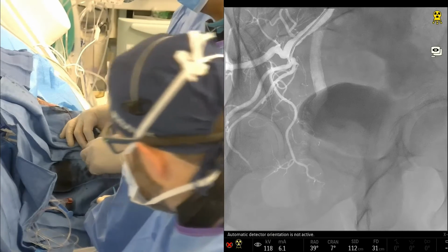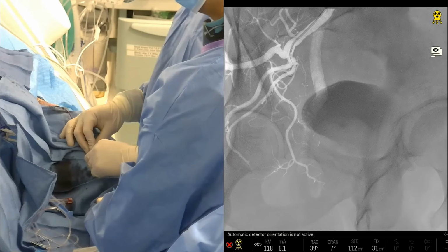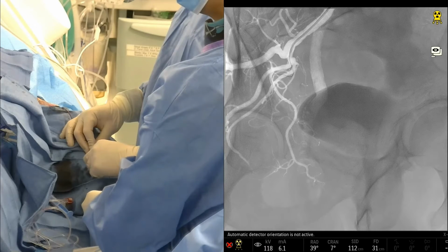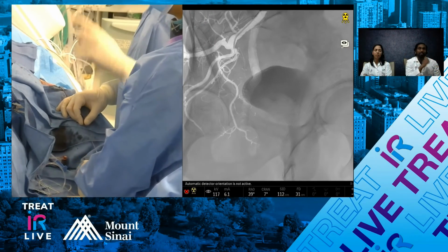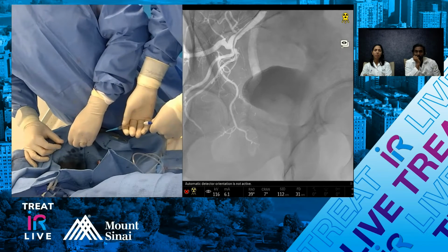Sorry, I missed that. So we switched. That might be it. Keep going. I thought it was a more lateral one. Maybe not. That's the rectal. More posterior. Do you want to shoot it? We can shoot it, but that's going to be the rectal check, because it's posterior to the prostate.